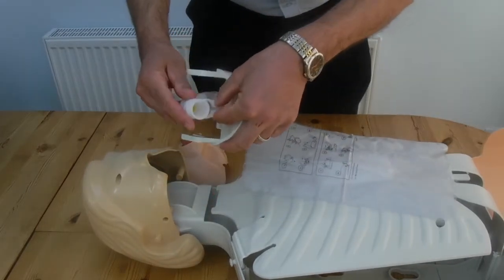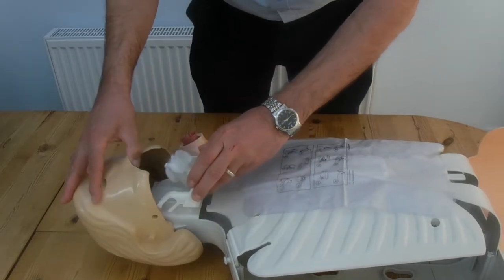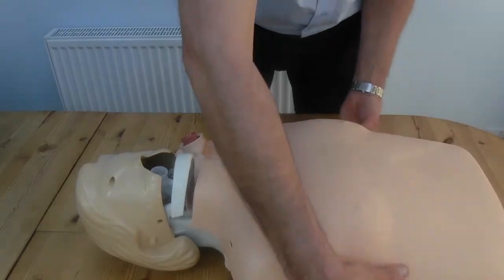Unhook the jaw, support the adapter, and click in the airway. That's where you have the lug that fits into the little recess — keeps it all nice and secure there. Make sure there's no kinks in the new lungs.